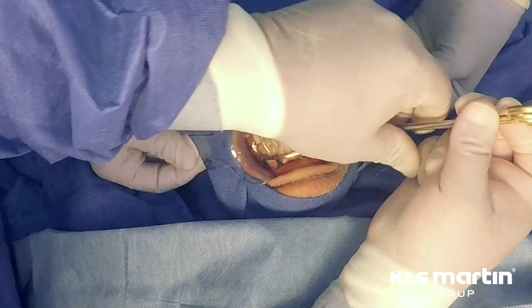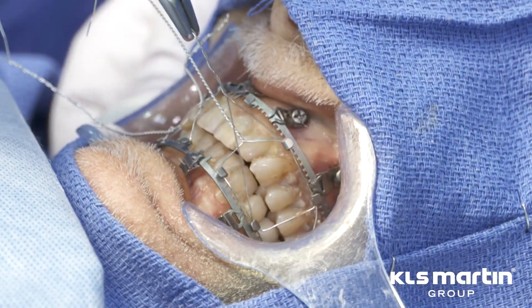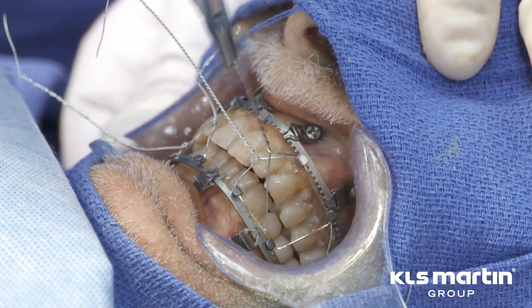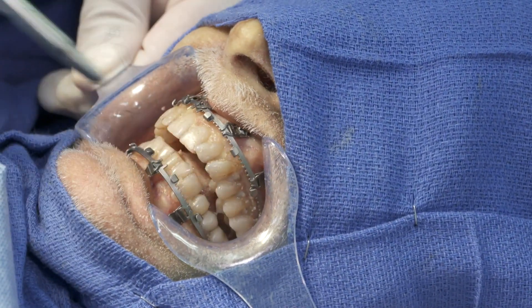Each hook can accommodate two loops of 26 gauge wire. Here we use a traditional box wiring method. As the wire is tightened, the system will gain rigidity as the slider plates engage the teeth along the arch plate.